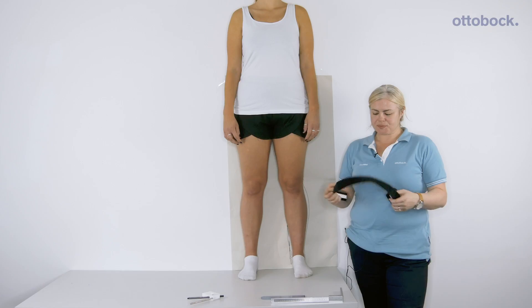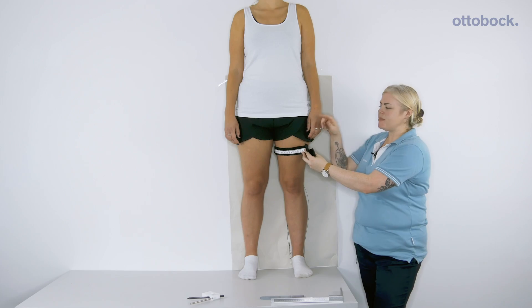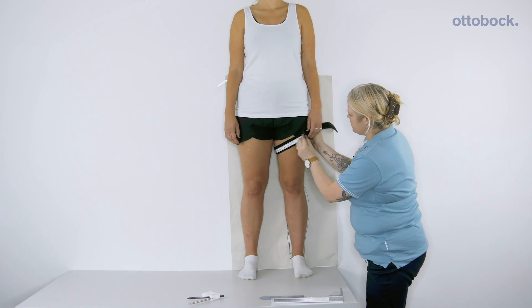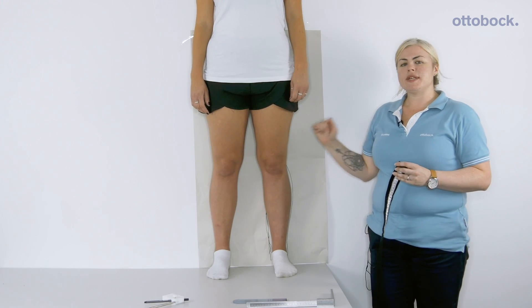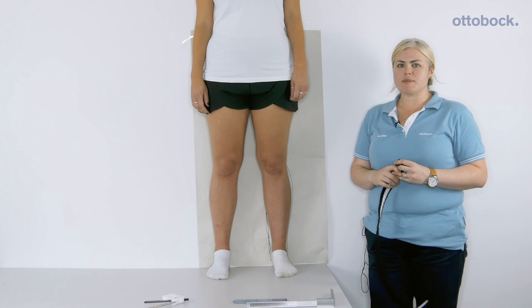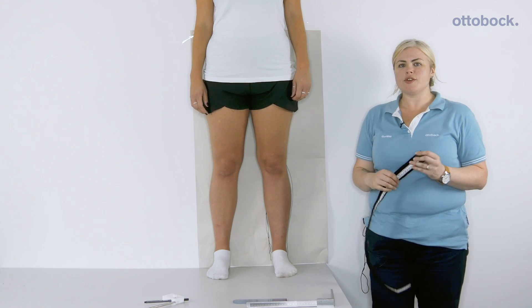Contact your academy orthotist or visit ottobock.co.uk. You'll just need your tape measure. T1 will be 40 millimetres below the groin and should be taken at a slanted level. All other measurements should be taken at a horizontal level. T2 should be taken 80 millimetres above the knee joint centre. T3 should be taken 80 millimetres below the knee joint centre and T4 should be taken 100 millimetres above the malleoli.